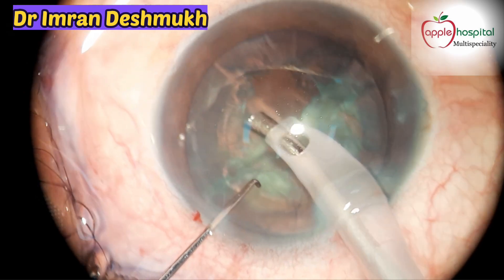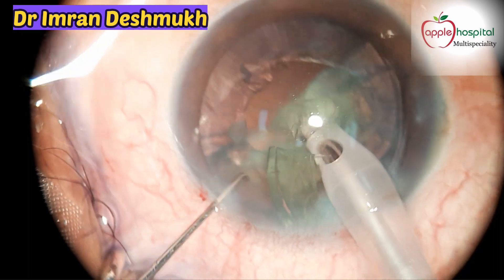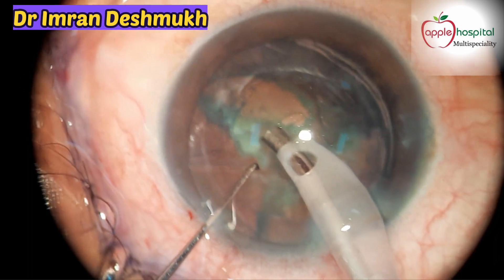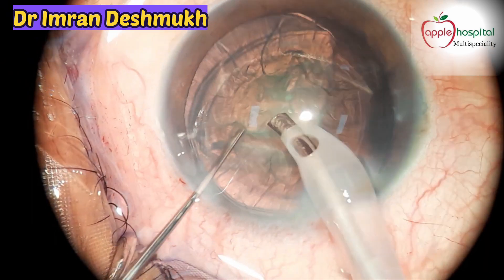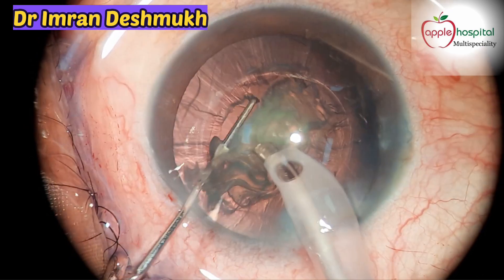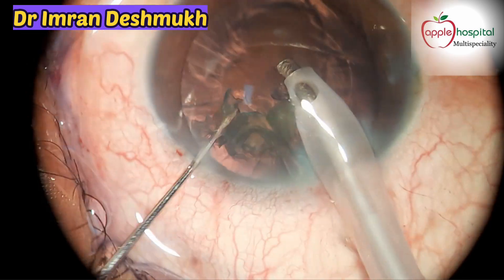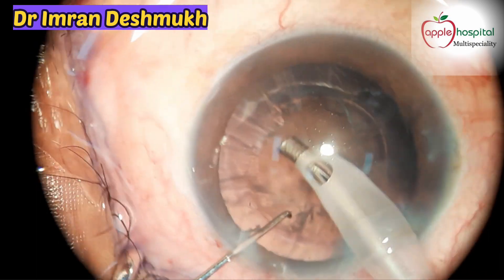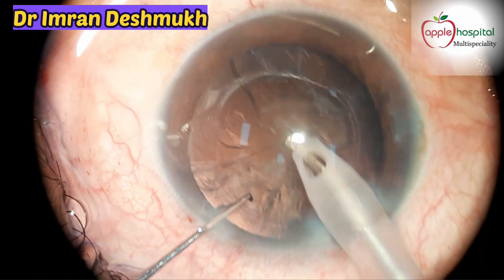As the nucleus is very soft, even a little vacuum can bring those pieces out of the bag, and it's very easy to emulsify these nuclear fragments. Use your left hand for all the maneuvering and keep the phaco probe in the center — stable. The last part needs to be emulsified at ultrasound 4 mode, which has very low vacuum.